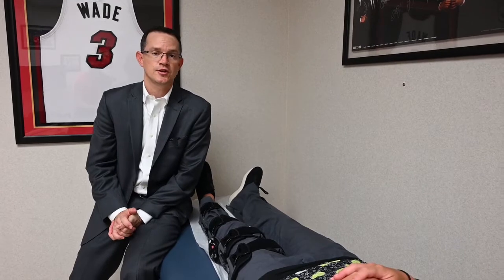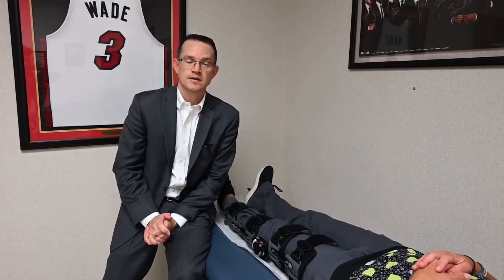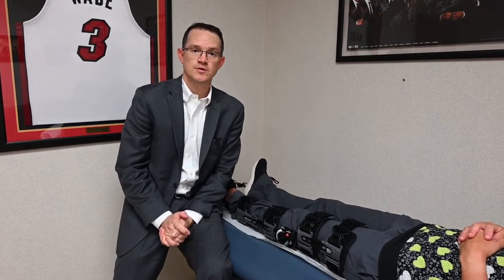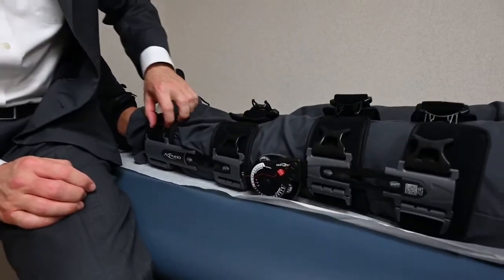There may be many instances where we actually want to remove the brace to do various different types of home exercises. Perhaps the most important post-operative home exercise following knee surgery is to be able to get the knee out into full extension. The knee always starts in full extension, but through the course of swelling and pain some patients have a tendency to lose some of their extension. To perform post-operative knee extension exercises, you want to remove the brace by popping all of the buckles.